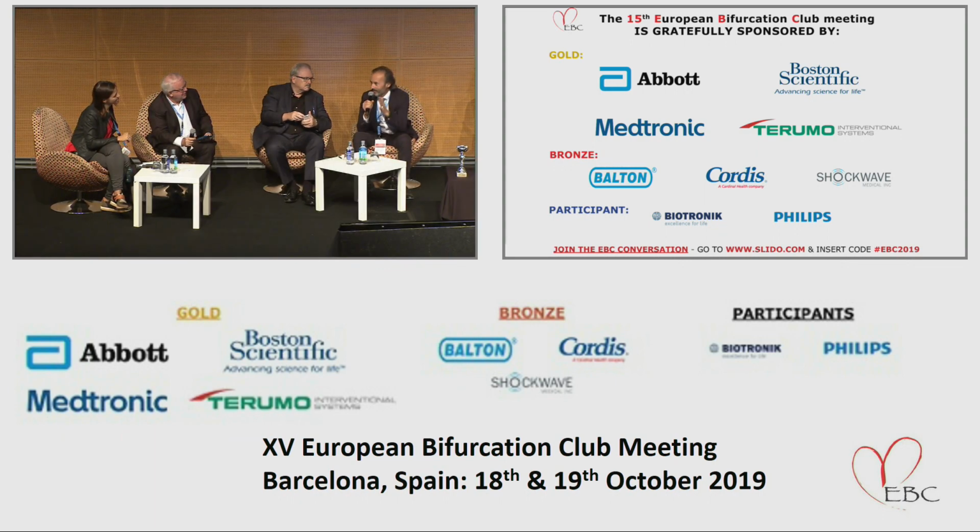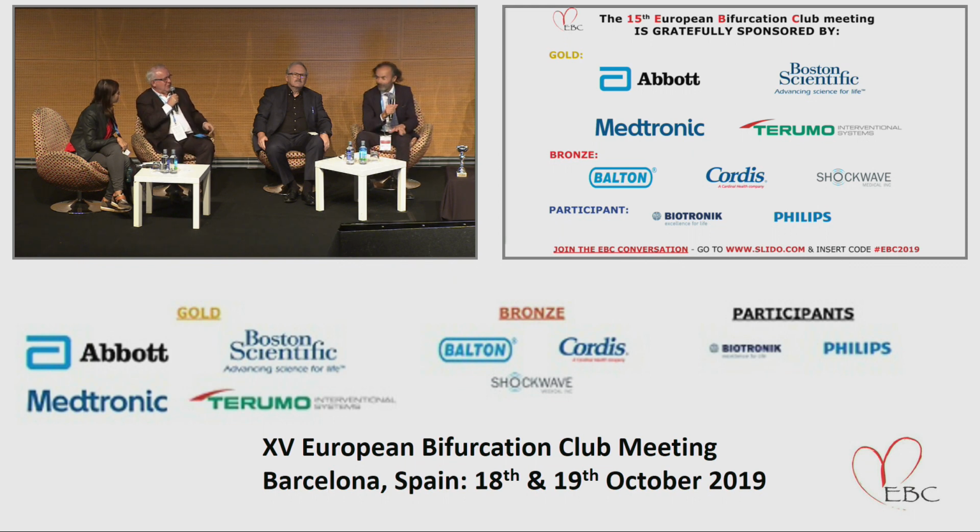When you put your first stent, there is the risk of longitudinal stent deformation. So the rule is, soon after you put your stent in the main vessel, the first thing before removing the wire is do the POT, because in this way you remove the jail wire as soon as possible. But why didn't you do the POT? Instead, he used the double lumen catheter to enter toward. So there is no more risk of going outside the stent, but there is a risk of longitudinal compression. Of compression, yeah.